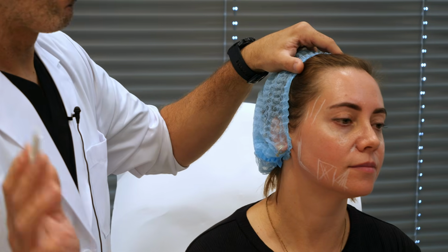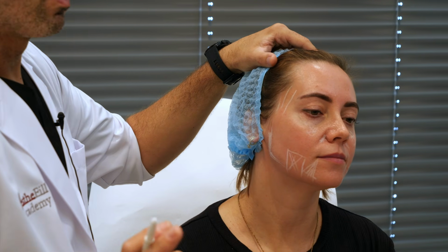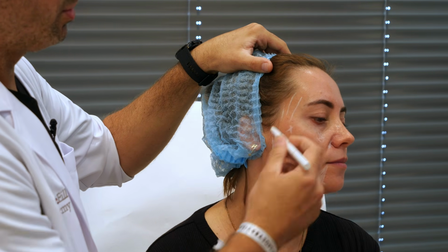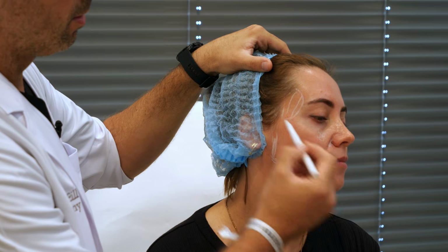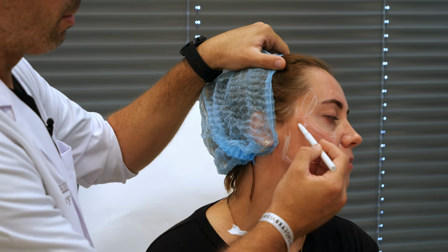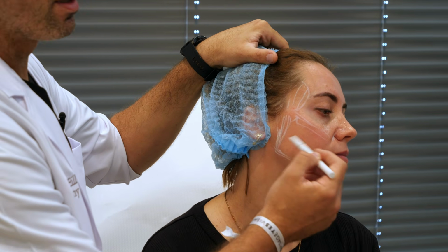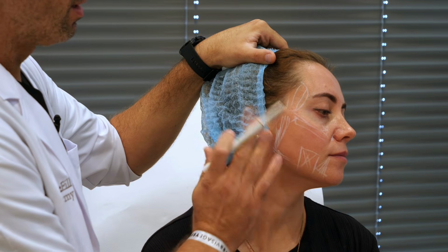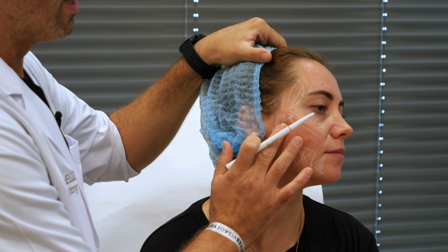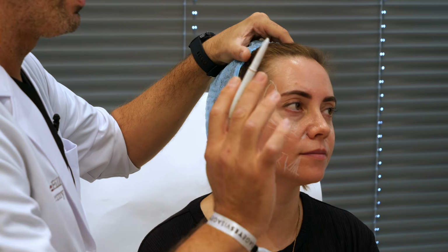Then, I begin my treatment with only about 2 or 3 entry points. This one gives me the possibility to reach the temple, the zygomatic, also the posterior pillar here, okay? There are ligaments, musculocutaneous ligaments, that potentiate the lifting effect, okay? And no volume. This is a round face, no volume here, okay?